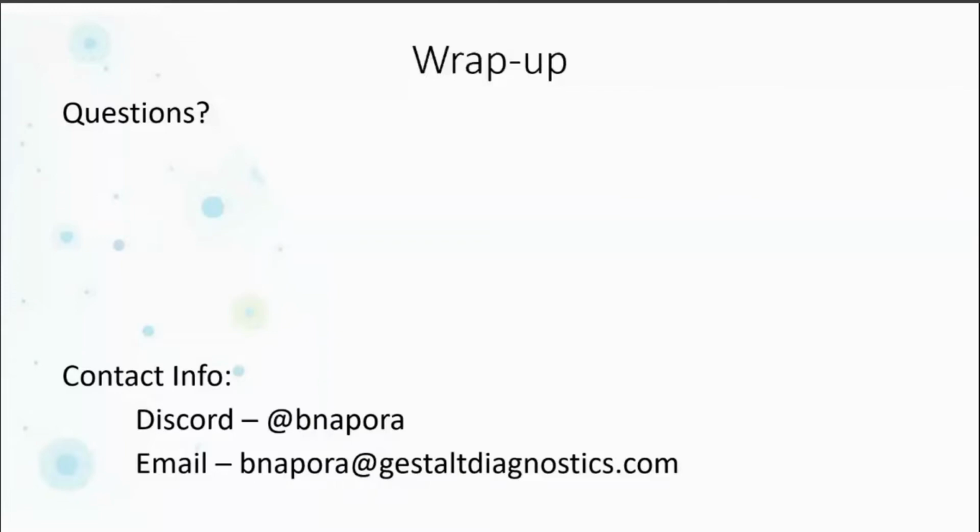At 2,500 patches, actually, I could bring up the illustration. That might take me a second.